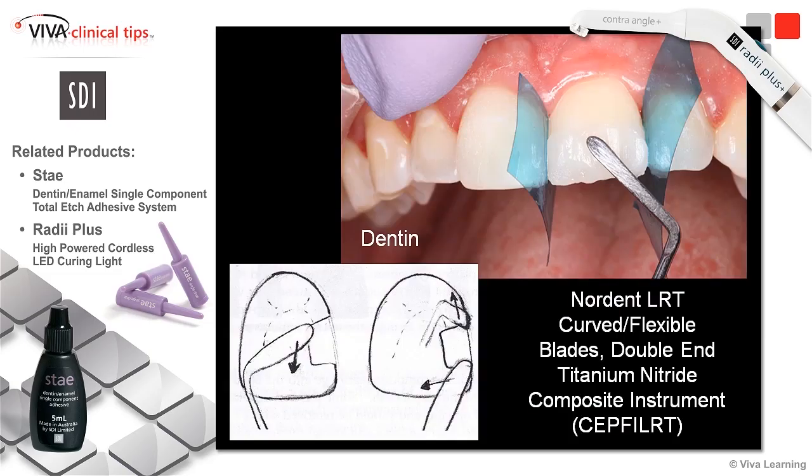Here I'm going to start placing my dentin shading. I'm using that Nordent curve tool we use on the anteriors as well as class fives, and on my marginal ridges on my class twos. As I'm placing this, the lower diagram really indicates how I'm moving and pushing this material over the surface, over the preparation, to really blend and get that creation of that chameleon effect. It's really important to move and push this.